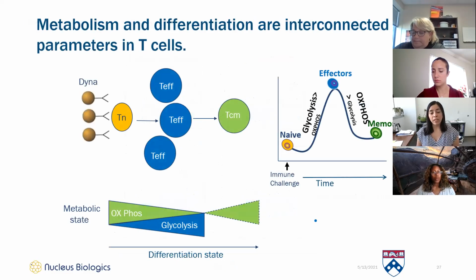Another important function that I wanted to check was the metabolic activity of these cells, because there is very high interest in the field about the metabolism, and we know that the metabolism is linked to differentiation. And as I explained in the previous webinar, we always wanted to have less differentiated T cells. That's why the second process of non-activated came in, because we wanted to eliminate the activation which triggers robust differentiation. So next slide, please.